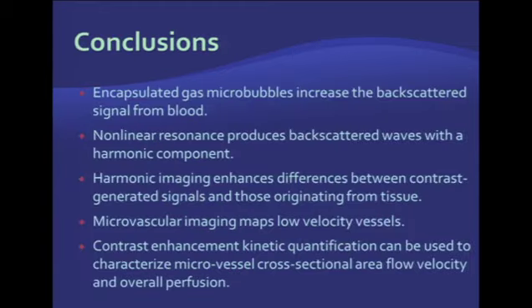As a conclusion, encapsulated gas microbubbles are very useful contrast agents for ultrasound. They increase the backscatter signal from the blood and substantially enhance ultrasound images. They produce nonlinear resonance, which can be detected by harmonic imaging techniques. Different ways of quantification are available to you.